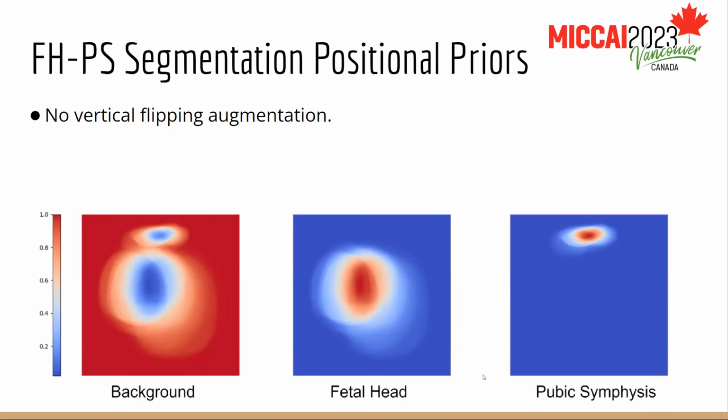So it makes sense that while we are doing our data augmentations, we don't use vertical flipping, because such variations we will not see over the training or the test set. In fact, if you use vertical flipping, in my case, it was not helping the model. This was our first takeaway.